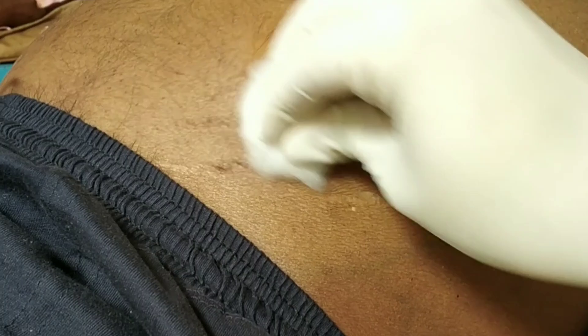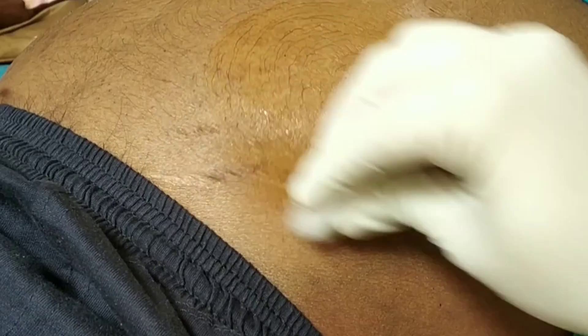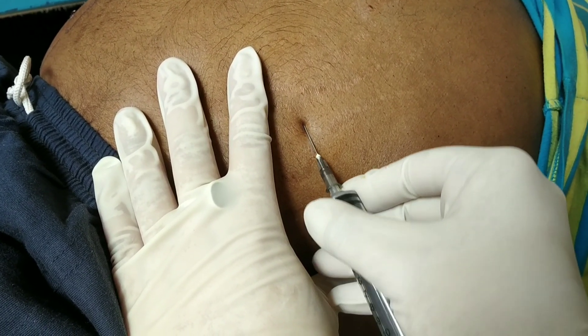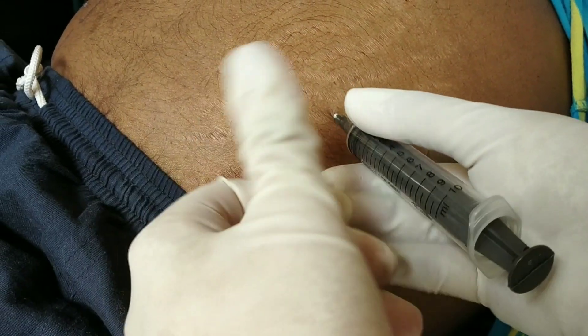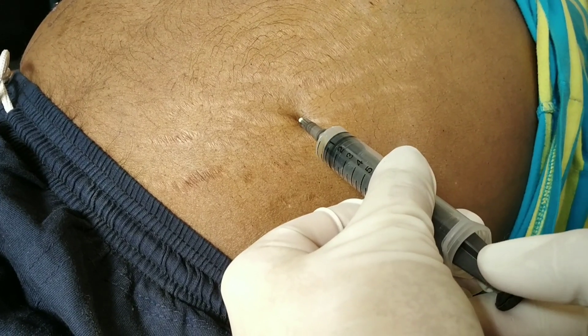First, sterilization with 95% alcohol followed by povidone-iodine solution. Then puncture a needle through the surface using the Z-track method: first straight, then forward, then upward. This creates a flap through the puncture area so it will automatically seal.